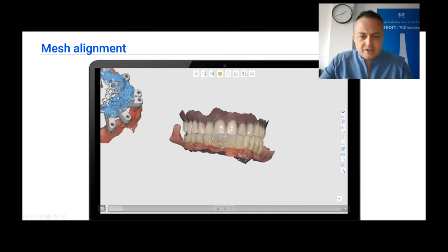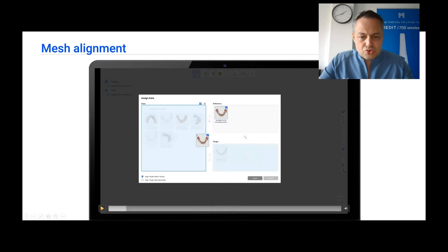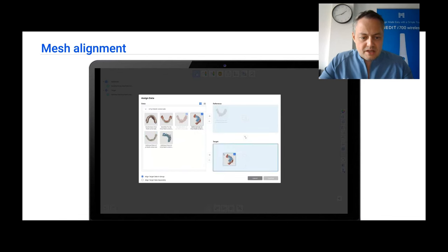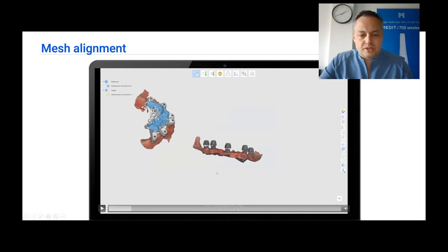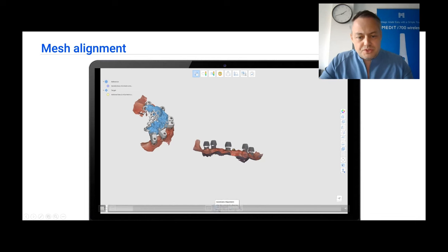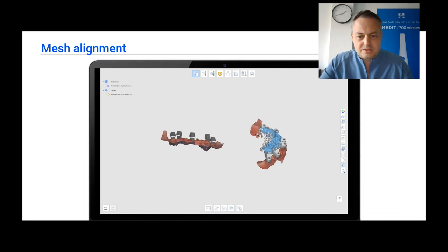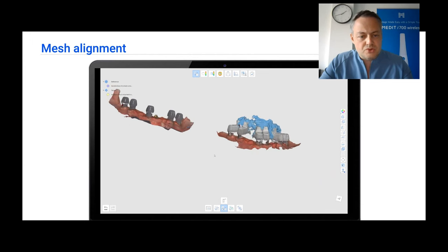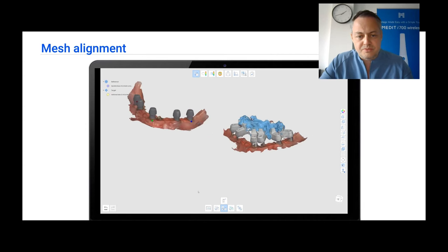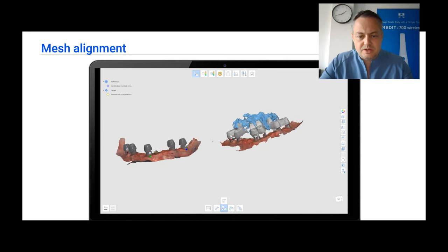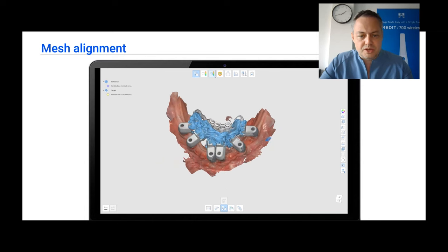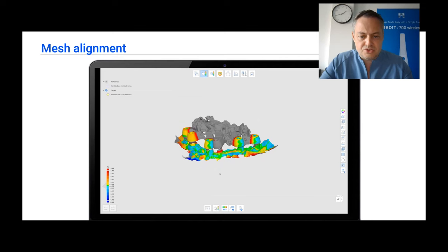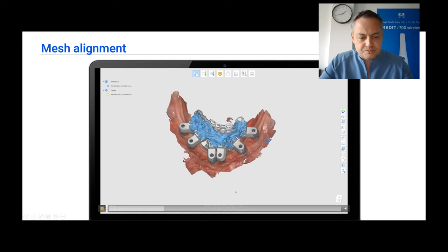As you can see, everything is green. Going further down the road, we are going to deselect these meshes and now align the op stage that contains the scan healing caps with the scan abutments. To be able to do this, we are going to try an automatic alignment, but this is very rarely possible because the information is so widely different. So we are going to look for data that is present in both scans. After we validate everything, as you can see here, we have these points and one in the middle, and everything is brought together. We check that everything is aligned — the gingiva has a green line all over the place. And now the scan bodies are in the correct position relative to the pre-op.